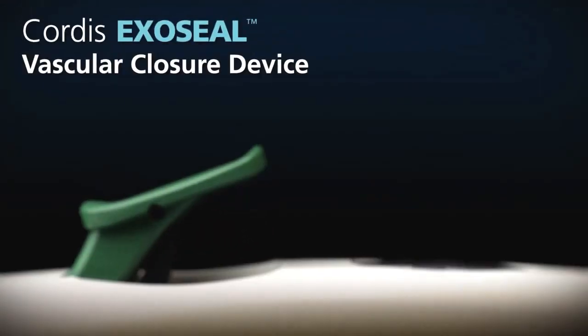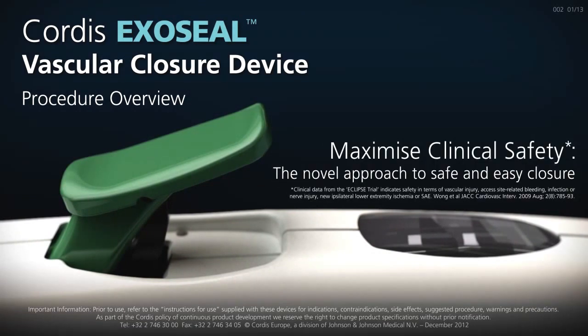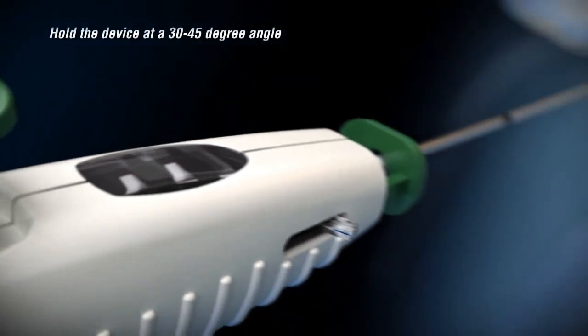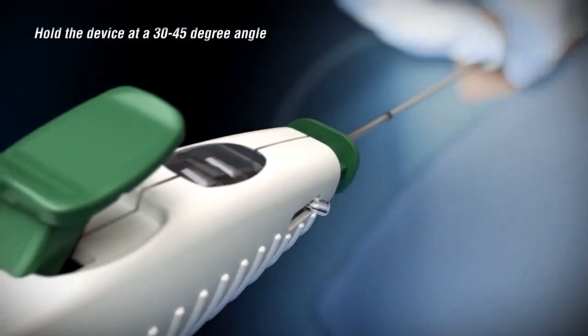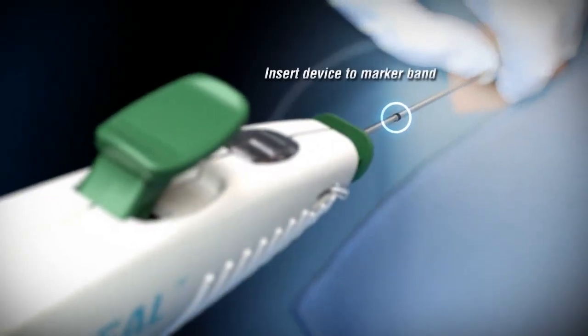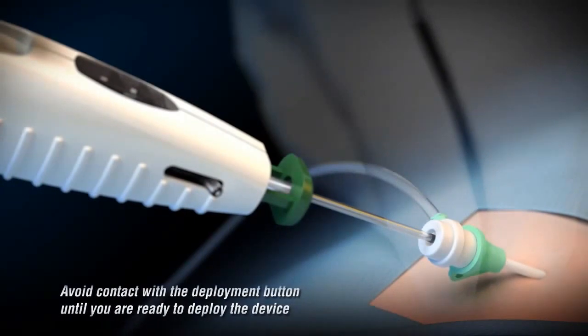Cordis ExoSeal Vascular Closure Device — Procedure Overview. Holding the device at a 30 to 45 degree angle with the indicator window facing upwards, insert the delivery shaft into the sheath up to the marker band. Remember to avoid contact with the deployment button until you're ready to deploy the device.